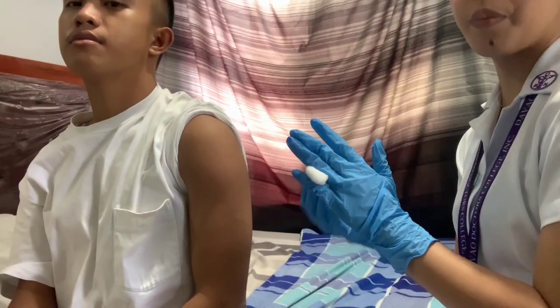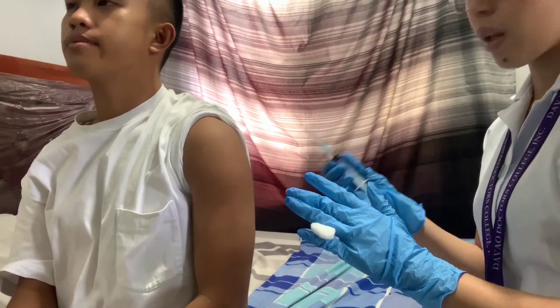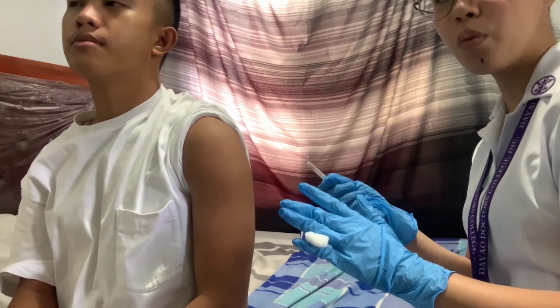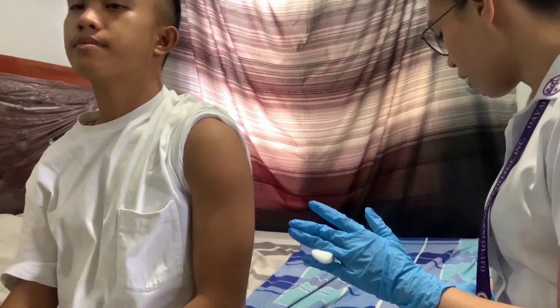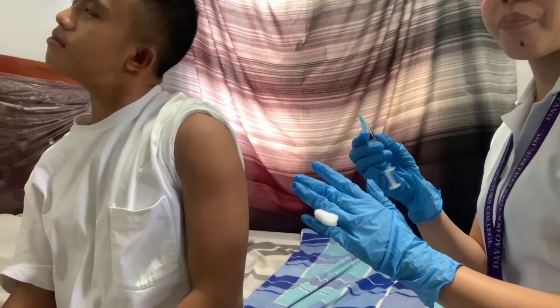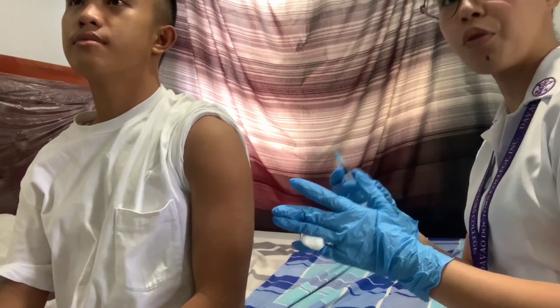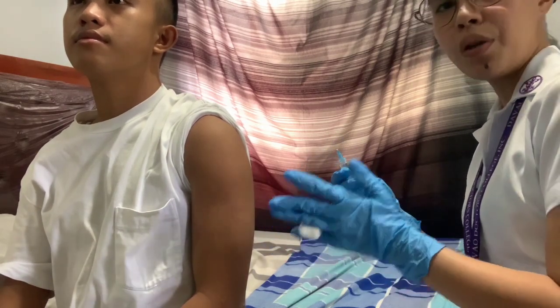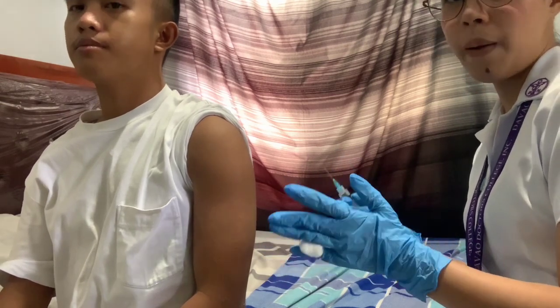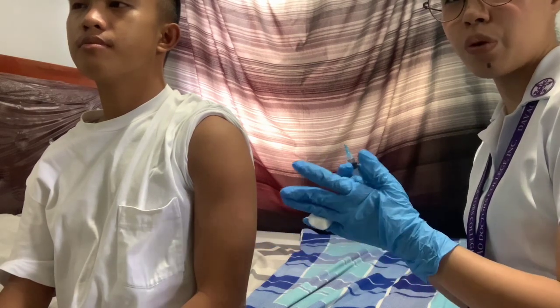So now we are going to prepare the syringe for injection. So we have here our 5cc syringe. So we are just going to uncap this. We are going to remove the needle cover without contaminating the needle. So remember that if we are using a prefilled unit dose of medication, take caution to avoid dripping the medication on the needle prior to injection.